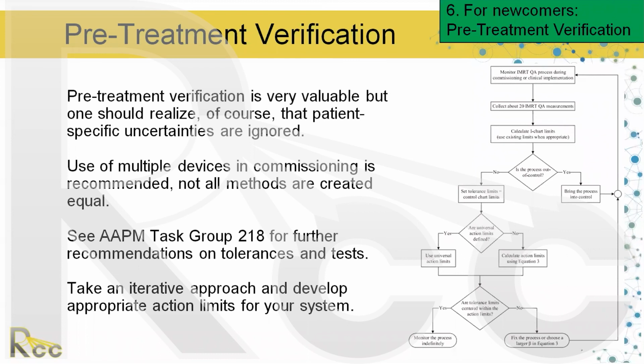Don't just use one system to check it all and be done with it. There should be some kind of cross-checking, cross-validation, at least in the initial phase, and then periodically ongoing. This is something that's often neglected: the QA equipment sometimes needs QA. And so sometimes you need to check the checker. And that's just part of the process.